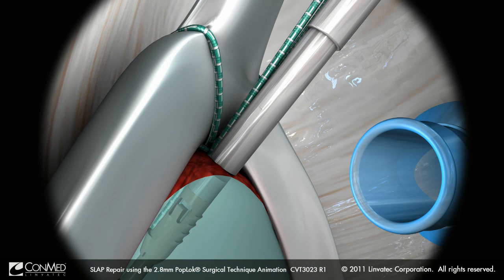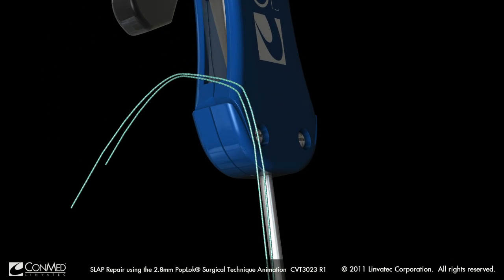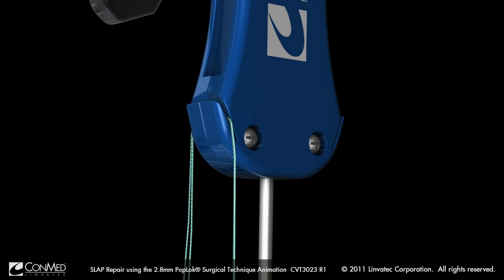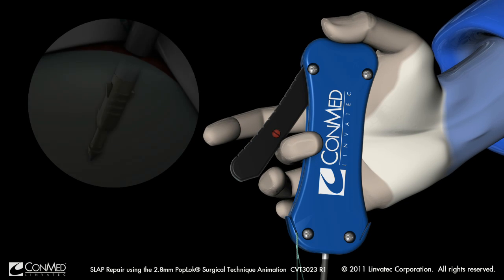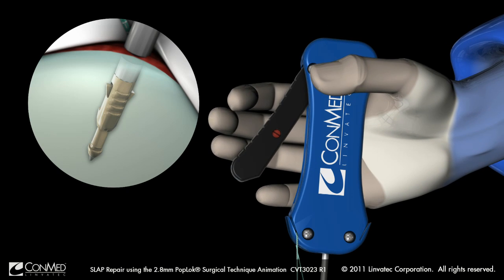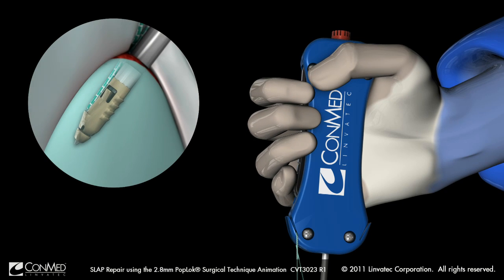The suture loop may be tightened by pulling on each of the individual suture strands. Once the desired tension is achieved, the suture ends may be loaded into the suture cleats on the implant driver. The pop-lock is then deployed by deactivating the safety lock and squeezing the lever until an audible pop is achieved.